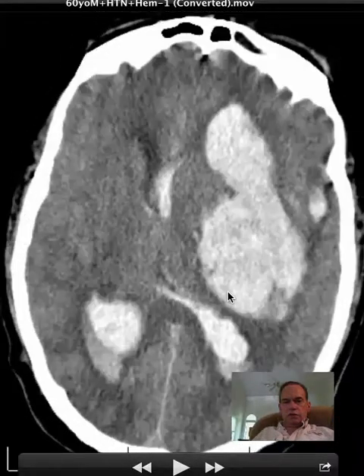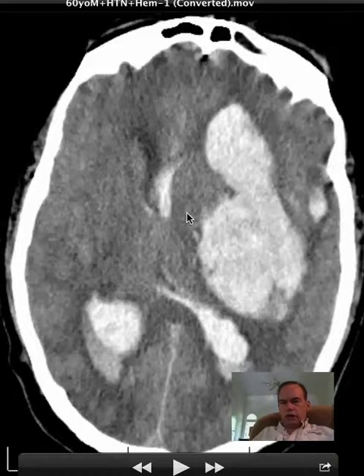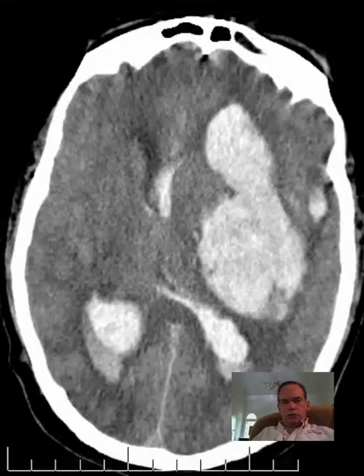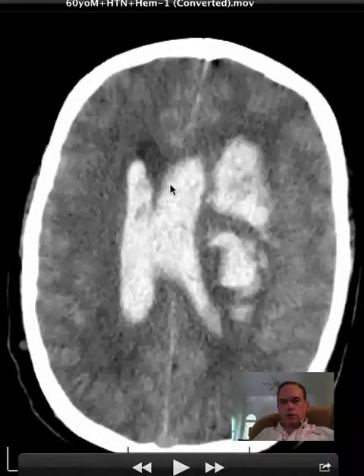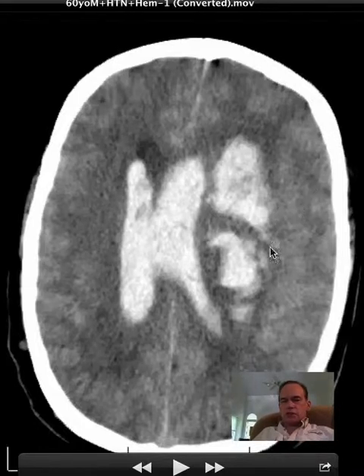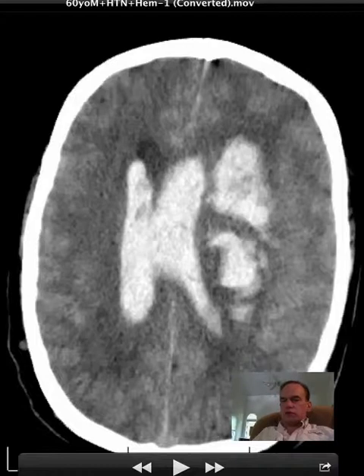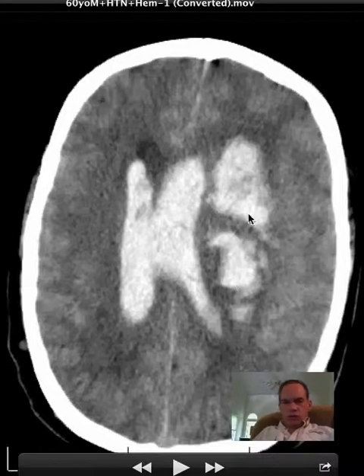Going up a little bit above, it would be important when reporting this to drop a straight line at the midline and measure to the shifted structure — that would be about 1.2 or 1.3 centimeters. Midline shift to the right would be part of the report. There's substantial mass effect with effacement of the cortical sulci. The sulci are the folds, and effacement means they're squeezed such that you no longer see the little trace amount of fluid normally present in the cortical sulci, as you do in less affected regions, because this area is exposed to direct pressure from the hemorrhage in the left basal ganglia as well as the intraventricular hemorrhage.